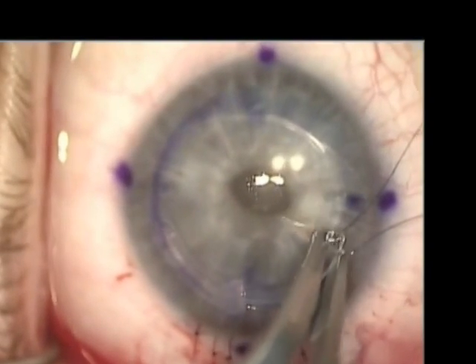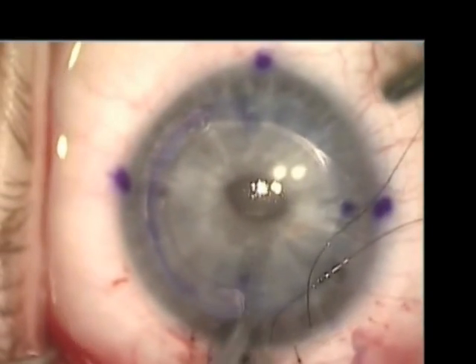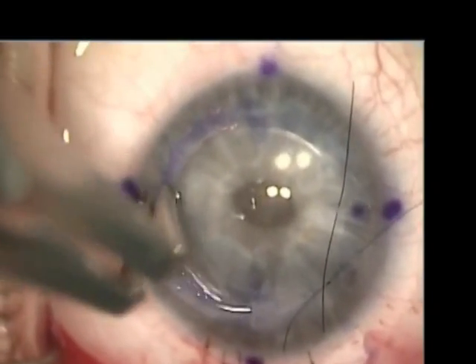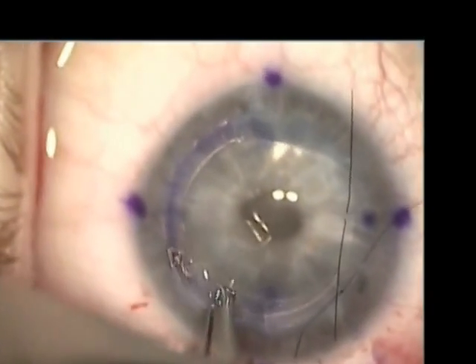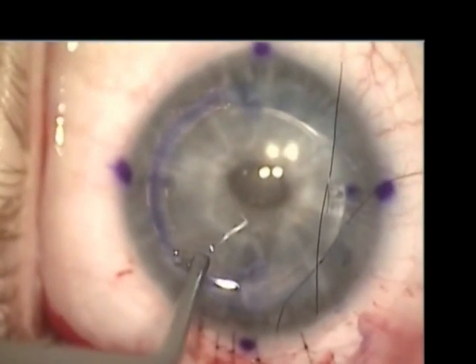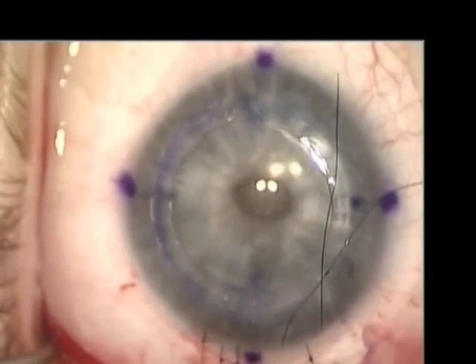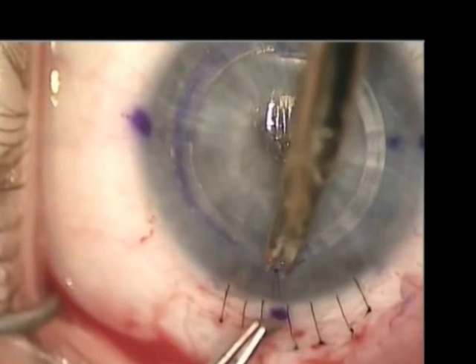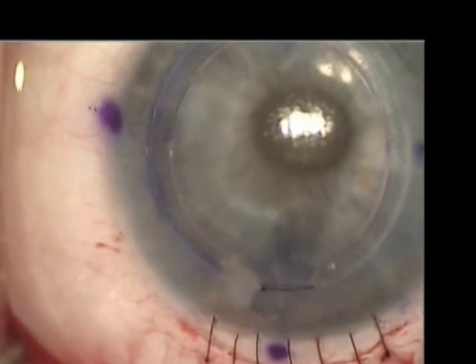Here the superior segment is carefully introduced into the superior channel. The same process is done with the inferior Intacs segment. A single 10-0 nylon interrupted suture is used to close the incision site. And that concludes the case.